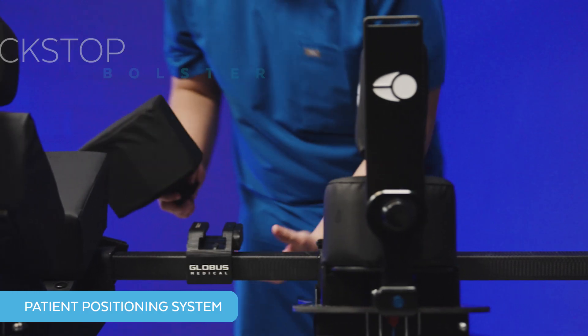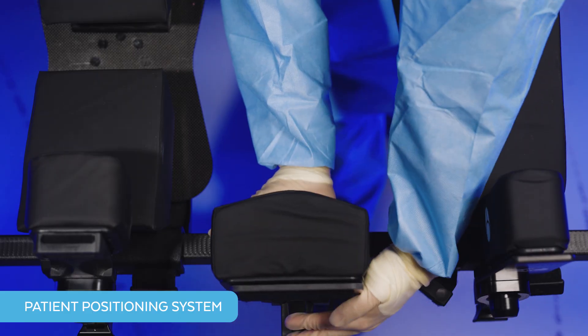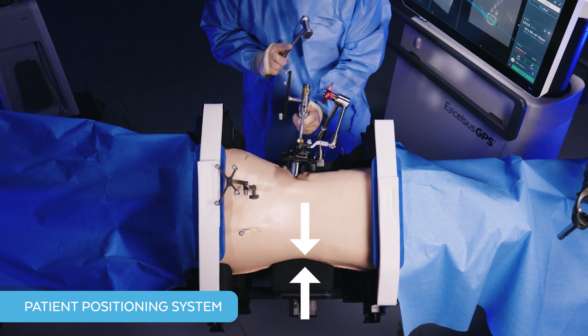Second is the most unique feature: the backstop bolster. This is on the contralateral side and helps mitigate patient and retractor movement from impaction forces. It's placed in line with the surgical site and translates in and out to accommodate patient anatomy.